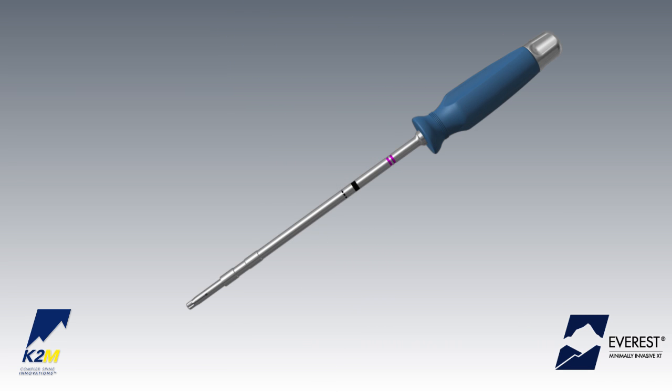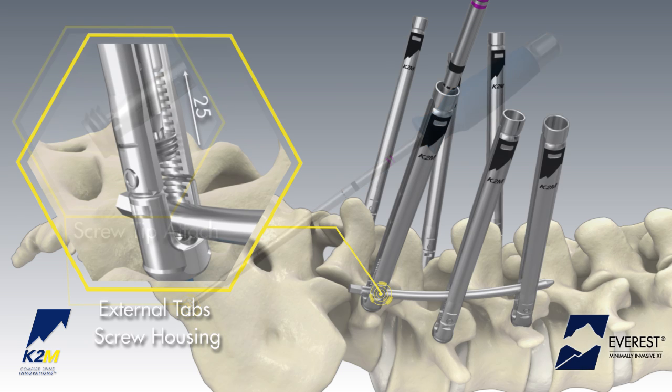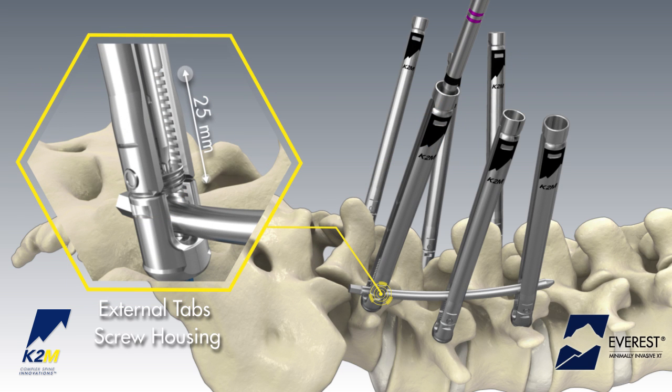Attach the set screw to the split-tip provisional driver by first rotating the dial of the driver counterclockwise to the open position. Engage the split-tip of the driver with a set screw and rotate the proximal dial clockwise to secure the set screw to the driver. Thread the set screw between the extension tabs until the rod is secured within the tulip.